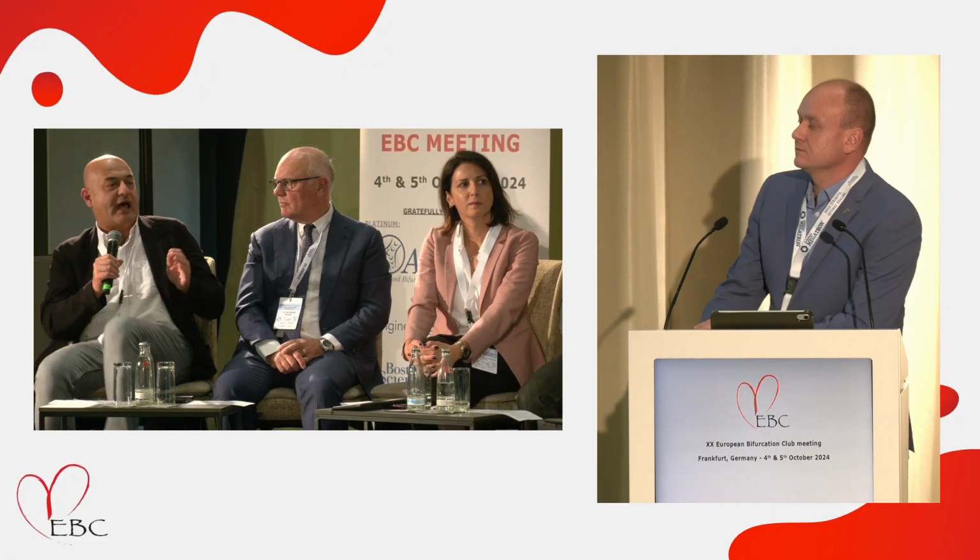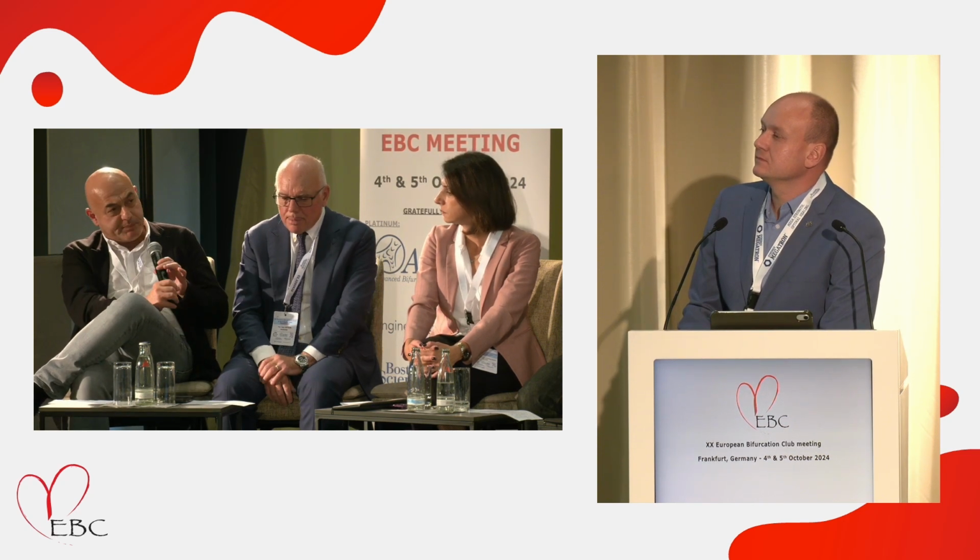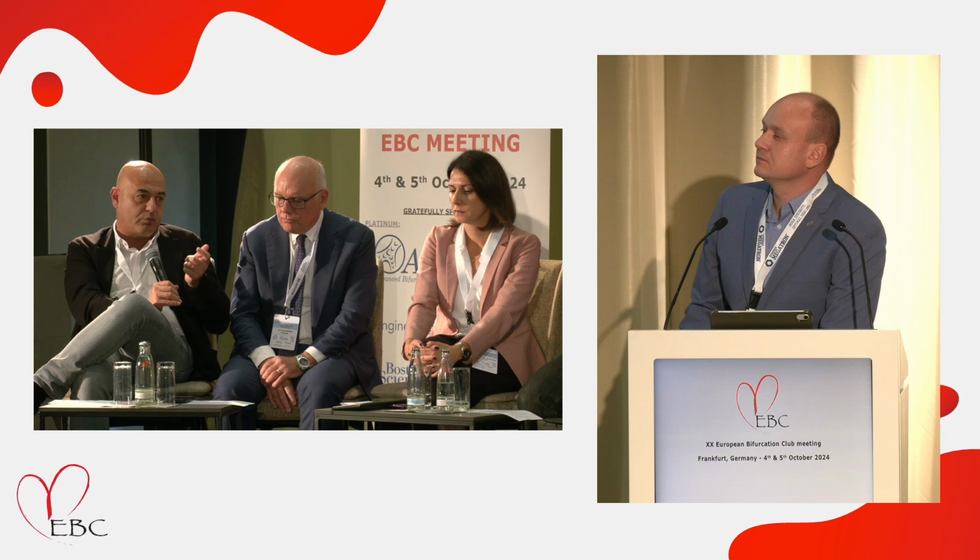You do the procedure, obviously put 2 stents, don't care whether you have 3 layers or 2 layers, and mostly you use lithotripsy, and you don't know what is the situation with the first stent, so it's better to cover it and not think about 2 layers or 3 layers. It's a perfect procedure. Yeah.